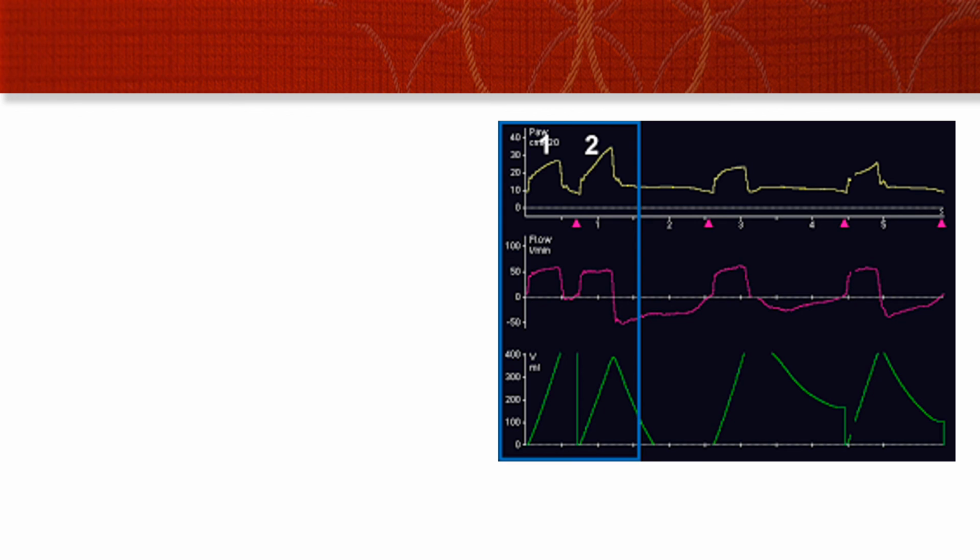Here's a third example of the same thing, and you see on the left side of the screen a volume control or Darth Vader style of breathing. And before the patient's fully exhaled, they get a second breath in. And you can see in between the two breaths, which is shown in red, that they're not really exhaling much at all. They're holding the breath at a pause and then sucking in air again for this triggered breath. And you notice here, since we're in a volume-controlled Darth Vader style of breathing, the patient will always get the tidal volume you've picked over the time that you've picked.